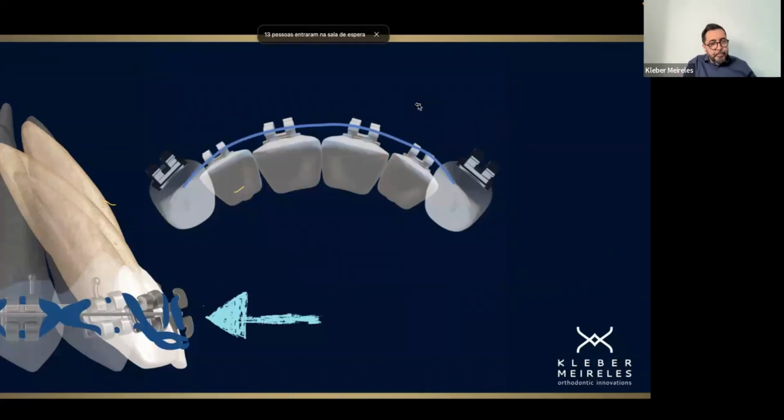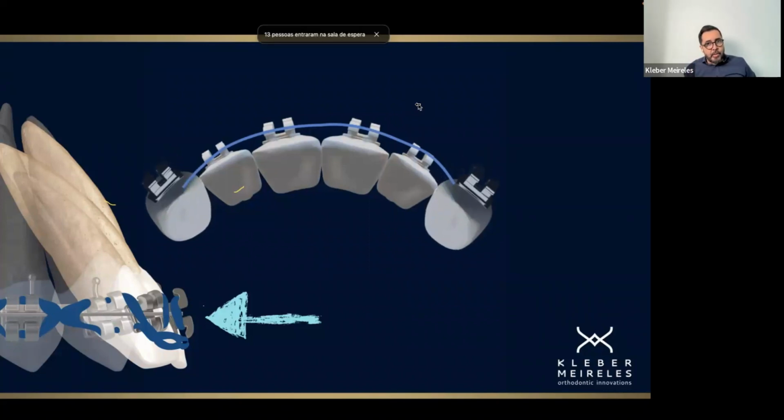Because of what I applied before: stiffness of the arch wire, contact points, and sometimes a bonus here, which is what we call the rowboat effect, but in this case in the right direction, distal. Sometimes we use that to help us correct a class 2 situation, okay? So we can do that when we apply a couple, but we can't do that applying just one force, okay?